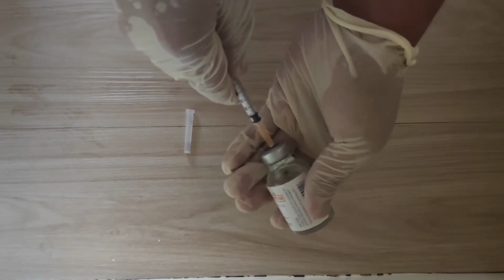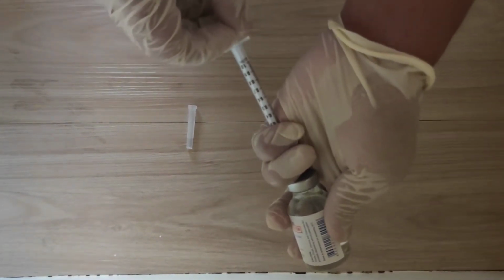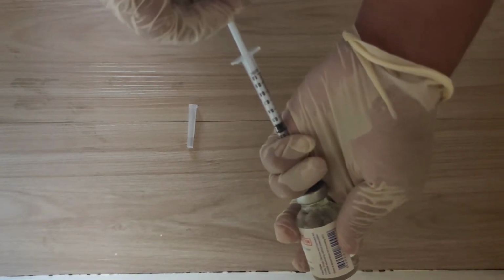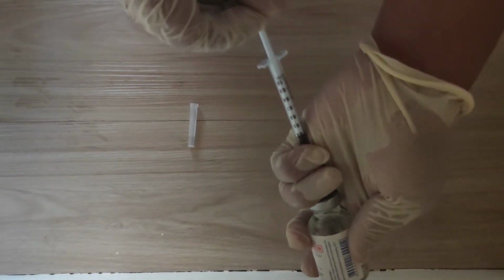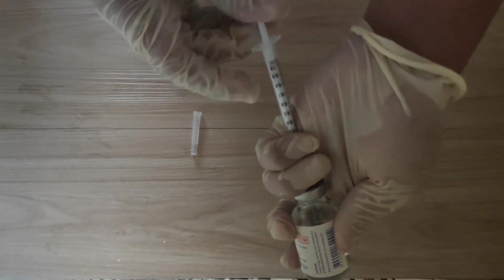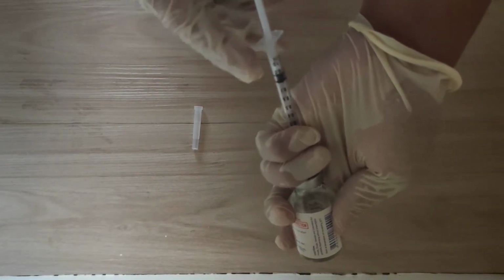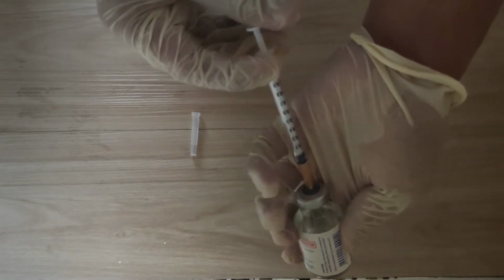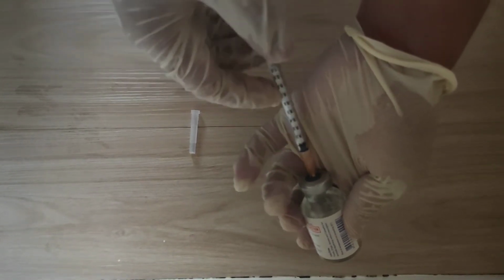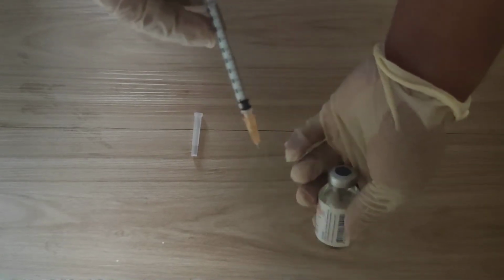So assuming that this is a heparin. Next, eject all bubbles from the syringe. All air must be ejected to maintain accuracy of blood gas values.